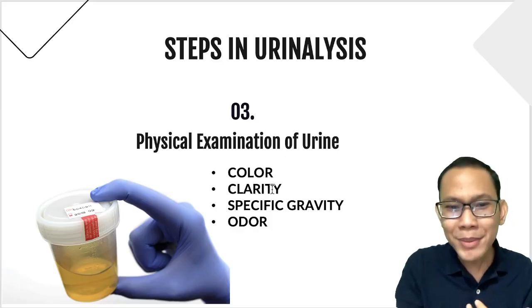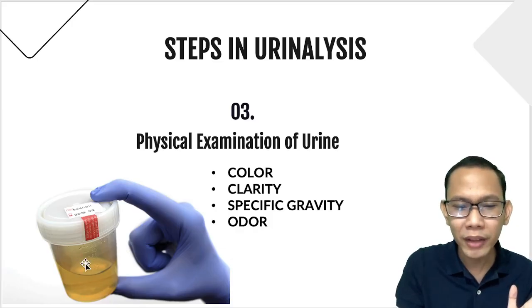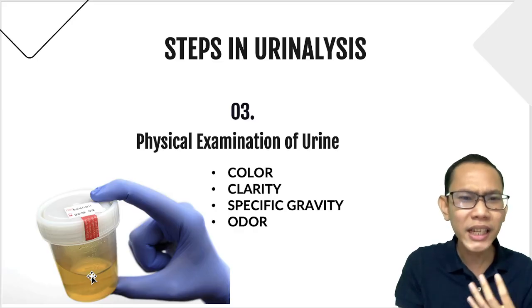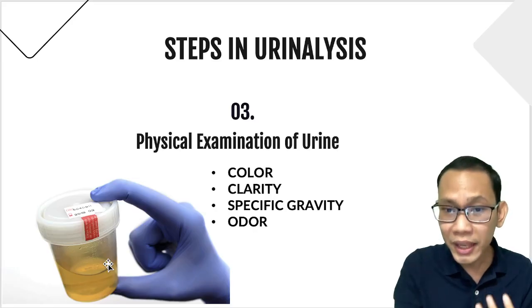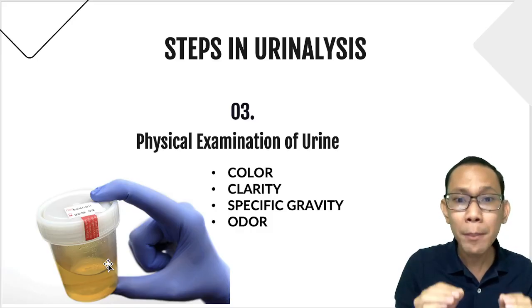Of course, sometimes some other medical technologists would say this could be light yellow, this could be dark yellow. But based on my observation, this is yellow. So this is very subjective. And the clarity, for me, this is clear. Some would say that this would be hazy. So meaning to say that it will be dependent on the medical technologists.